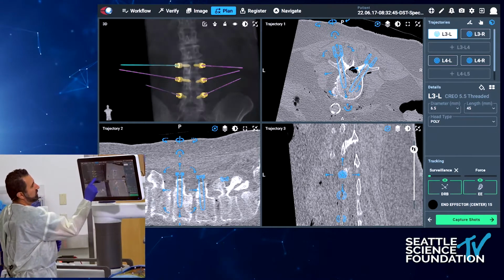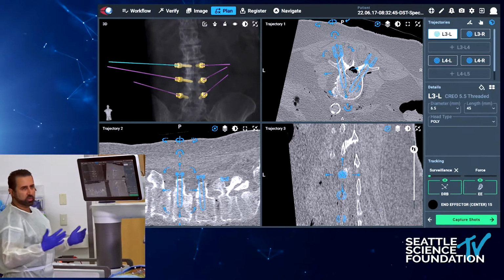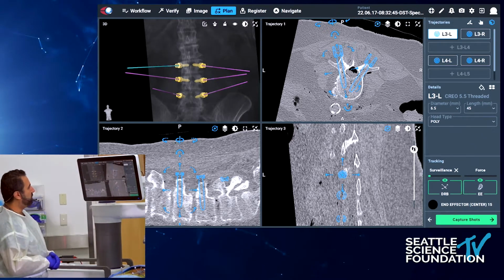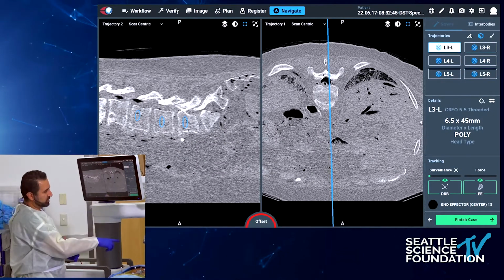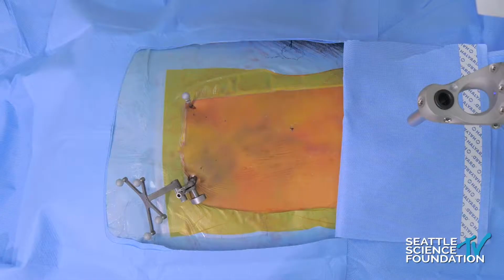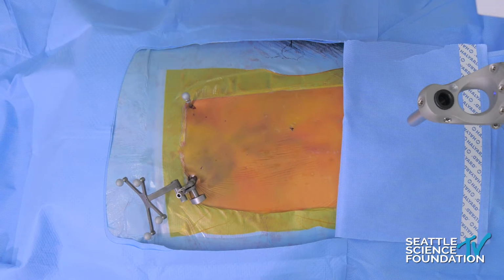So preoperative planning is such an important part of this, and that doesn't change whether you're doing fluoroscopy, CT navigation, or robotics. So, okay, we're ready to proceed. This is the end effector part of the robot. This is the monitor, obviously. We have a dynamic reference base, which is like the radar with respect to the camera. So it communicates, triangulates between the end effector, the DRB or reference frame, and the camera, which is up here.